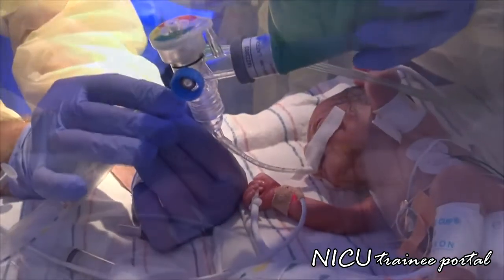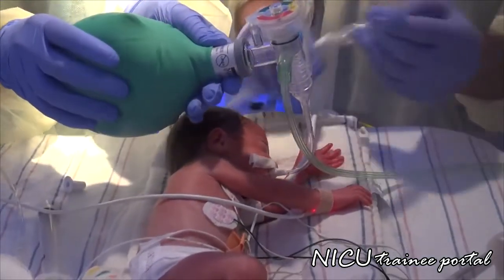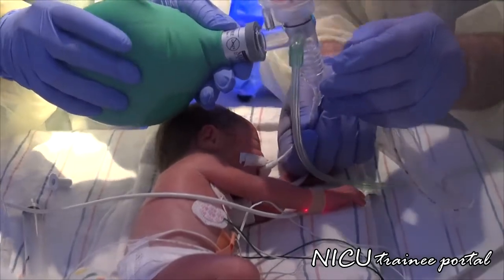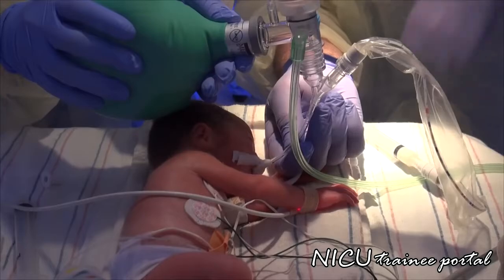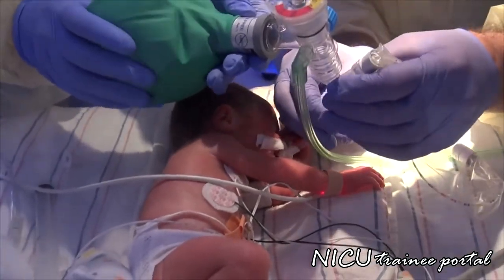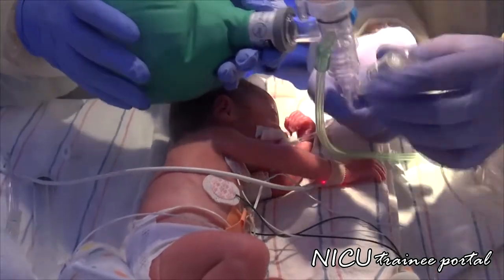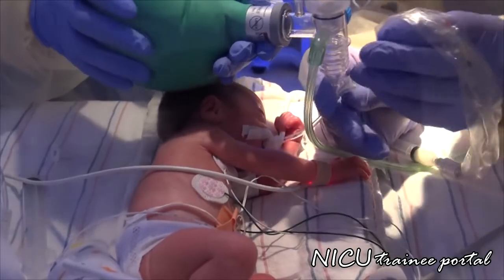Sometimes it backs up. Old eyes just don't work like they used to. I'm just going to take this off. Yeah, there we go. You ready? It's on the side, right? Yeah.